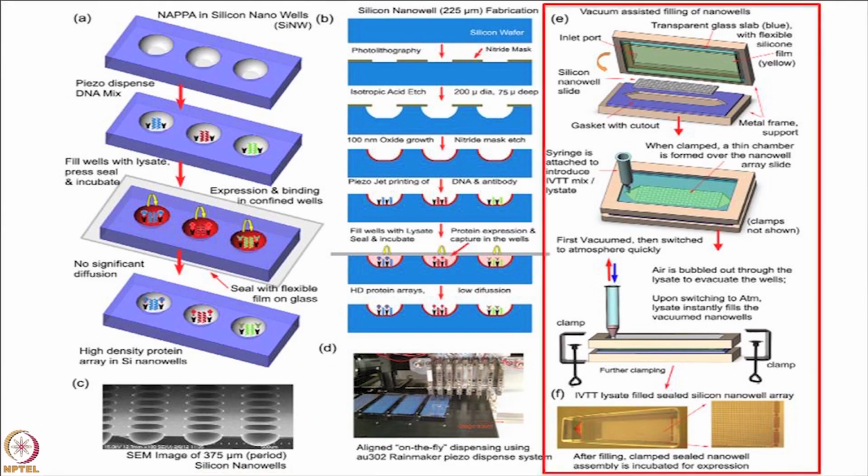Okay, so what Peter did to seal these wells, he developed a system where he had two flat plastic laminate surfaces, and sandwiched in the middle he has a clear liquid oil. That whole system is connected up to a pressurized system. And so the minute we finish putting in the expression lysate, he adds pressure to the oil.